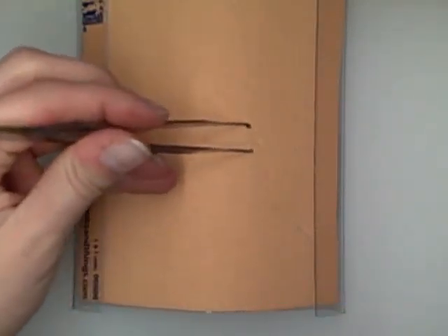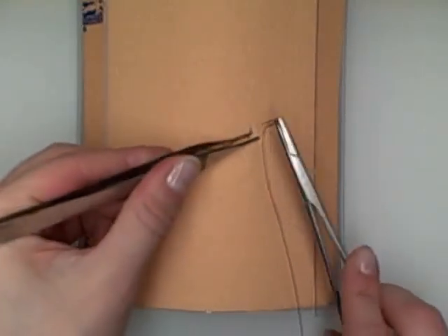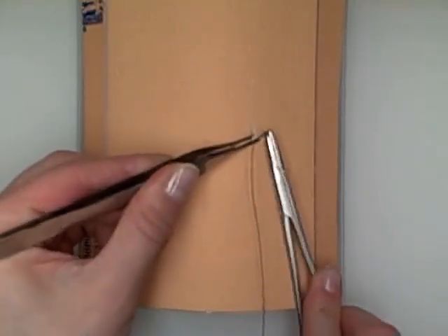Okay, so now we're going to do a horizontal mattress suture. You can see our incision is right along here. So you're going to start out the same way you would for Simple Interrupted.